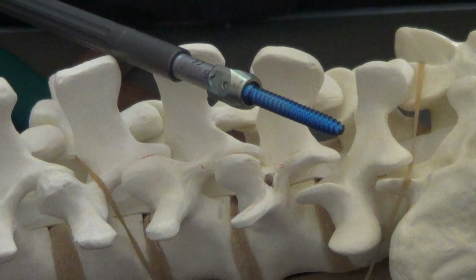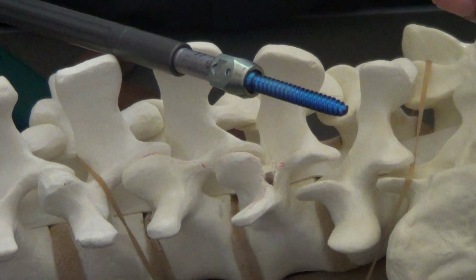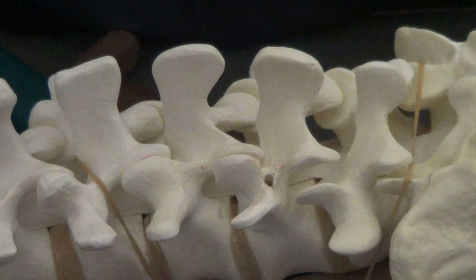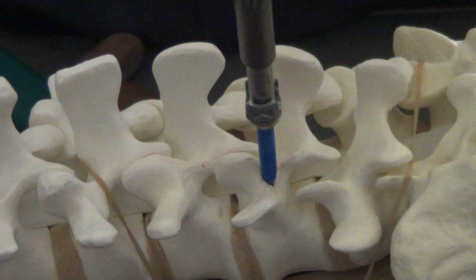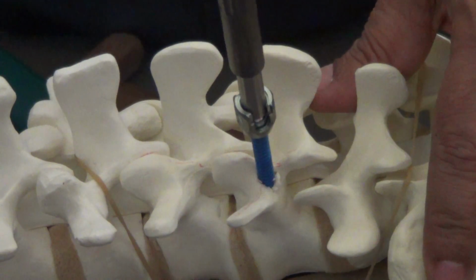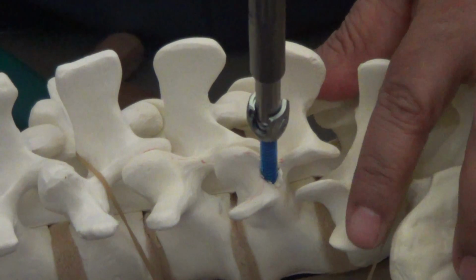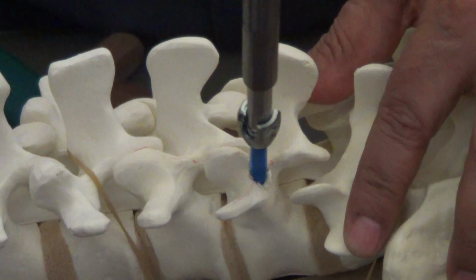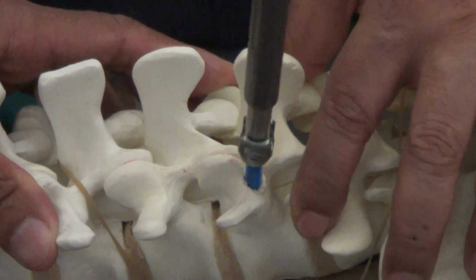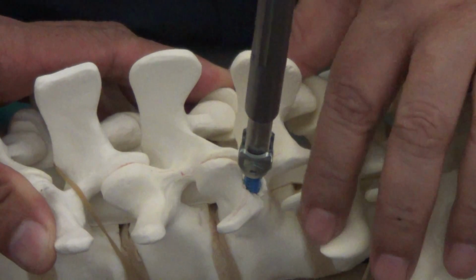I mean, again, you see the lateral view of the X-rays, and you'll be able to decide what your screw size is. So, in the lumbar spine, 6 millimeter, 6.5 millimeter is a good screw. Now, the other thing is that you got to angle it in slightly, and this is a ratchet here. So you just have to turn half. You don't have to go all around turning, because you land up with a tennis elbow, right? So you gently go half turn, and you'll be able to insert the screw in. It's always better to angle it about 20 degrees inwards.